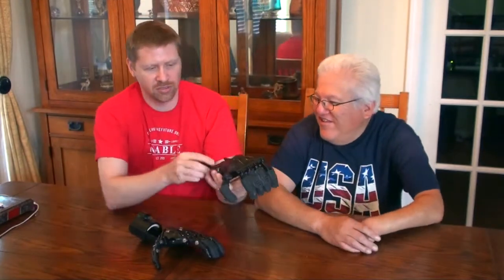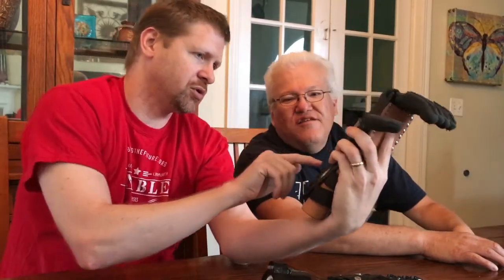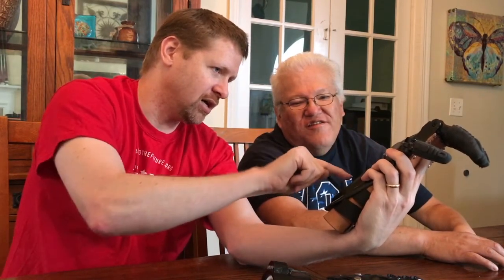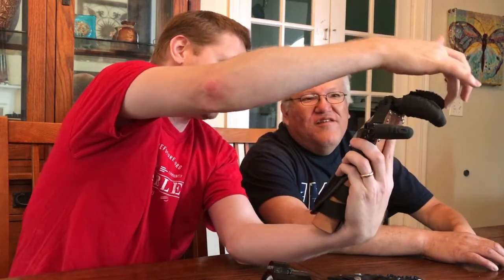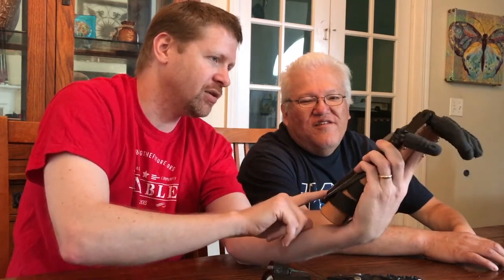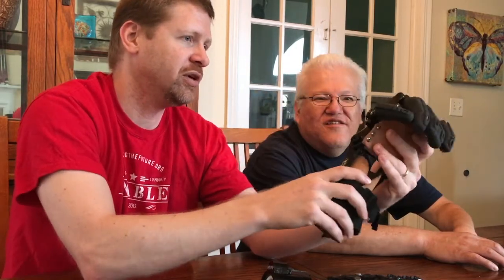That's a good question. There are set screws in the back — you can see them right there, a whole grid full of them. You'd use an appropriate-sized Allen wrench. There are two screws for each line — this line is controlled by those two, and these two control the next line. So you just loosen those two screws, and that lets you loosen the line that connects to that finger and across. I can give you an Allen wrench today so you can make those adjustments yourself — just loosen the set screws and adjust the fingers to whatever tension you need.